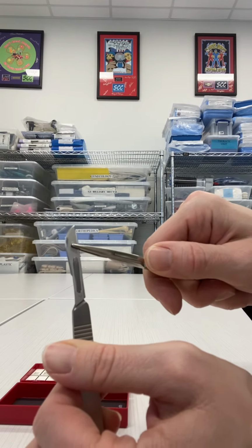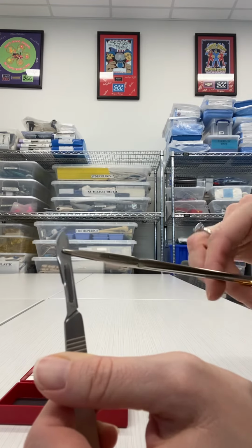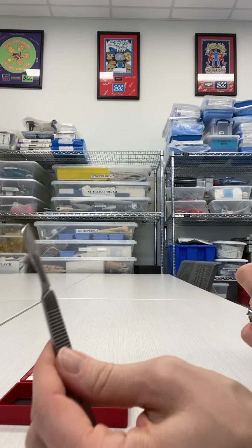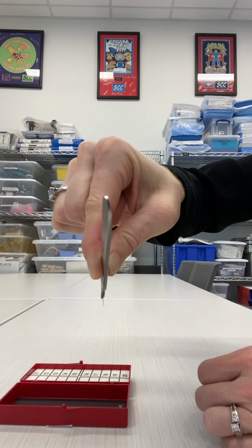I can also pull back on the blade to make sure that it's seated appropriately and actually attached to the knife. And then I go ahead and release my needle holder, and then my scalpel is ready for me to hand up to the surgeon for use at the sterile field.